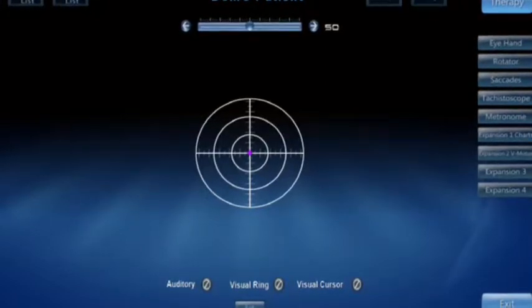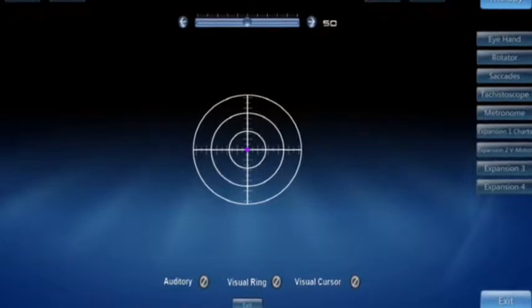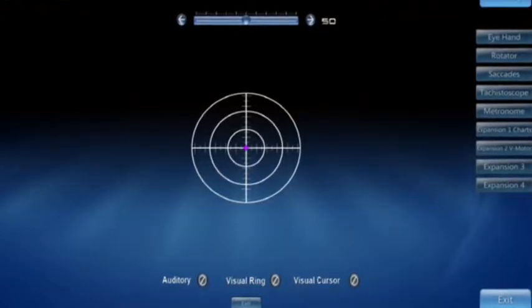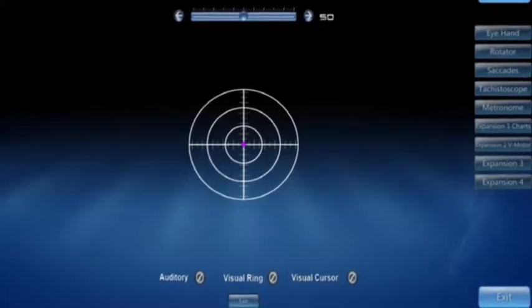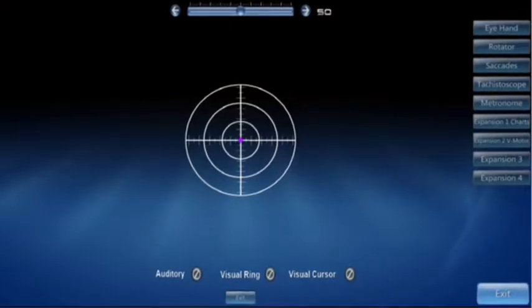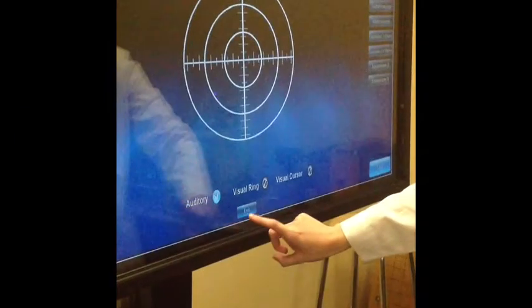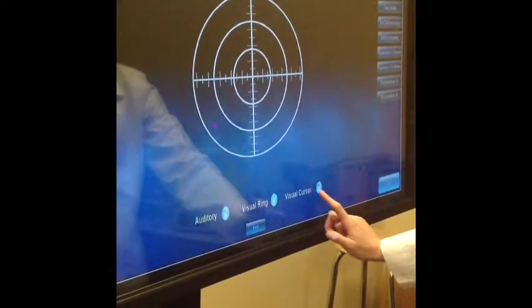You can change the size of the Balance target by using the top slider, making it bigger or smaller. In order to use the Balance feature in the other sections of the Sanit, you need to click the buttons on the bottom of the screen. These buttons will provide visual and auditory feedback to balance while doing the other sections of the Sanit.